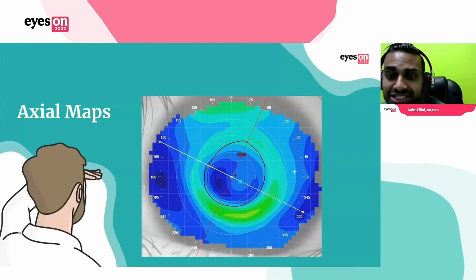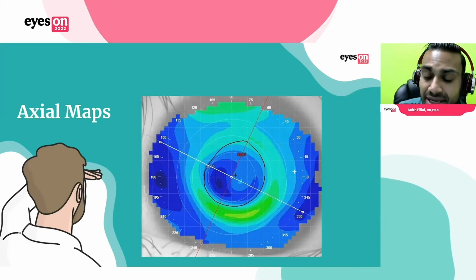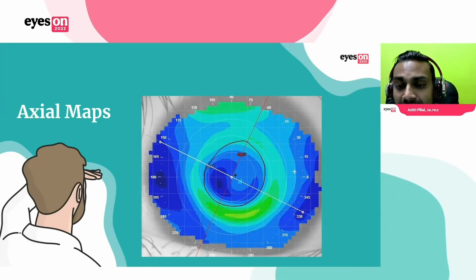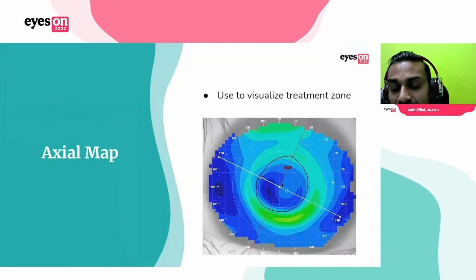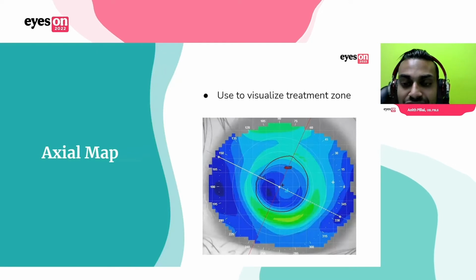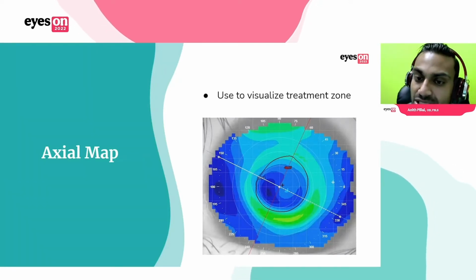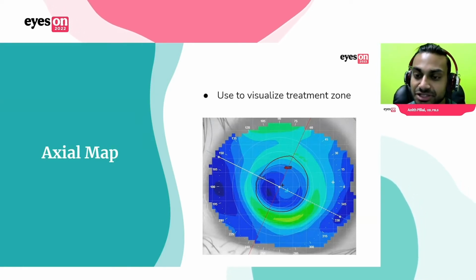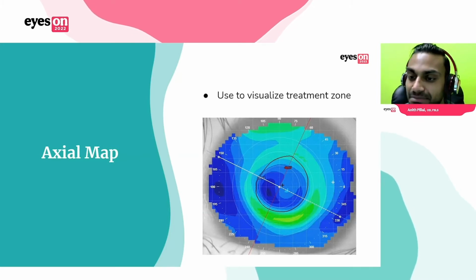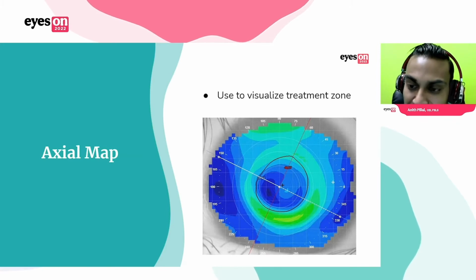So first, we'll go into the axial map. This is probably what we're most accustomed to seeing and using in our clinical practice. And the axial map is really, really good at looking at the treatment area. How much treatment do we get? How big is that treatment zone and how much correction do we get? So what I'm focusing on here is basically that central blue circle. I want to make sure that I'm getting the vision correction that I anticipated, that blue area is nice and uniform within the pupil area, and I'm getting a centered treatment zone.